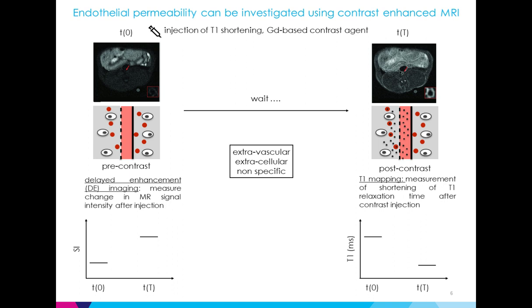The endothelium in this case is permeable, while the right side is not permeable. And in the schematic after contrast, you can see these small black dots representing the contrast agent in the vessel lumen extravasating in the tissue, and also present inside capillaries in the tissue, but not in cells, because these contrast agents that we're talking about today are actually extracellular. So basically, that is the basics of the process.